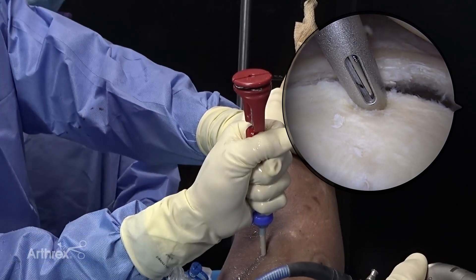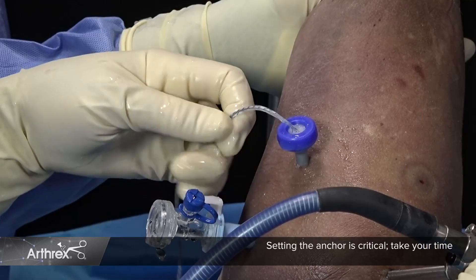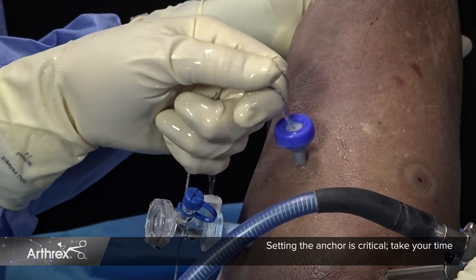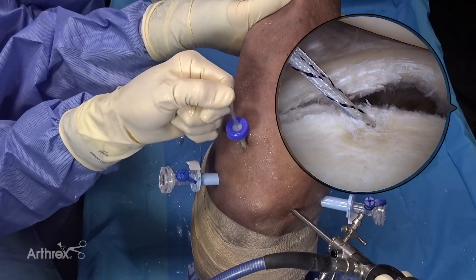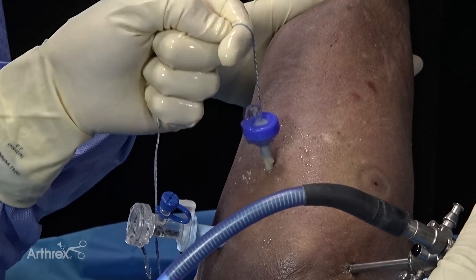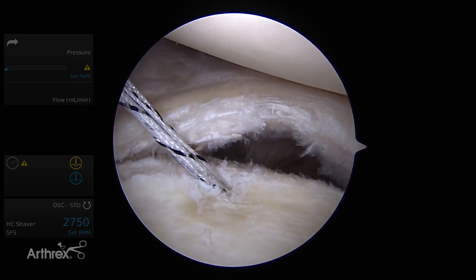At this point, you're ready to set your anchor, and I would encourage you to take your time during this step. Once the drill guide is removed, I recommend grabbing all the sutures and gently applying a steady pull in line with the cannula to set your anchor. I would also advise visualizing the anchor setting with the scope. You can certainly see how sturdy this anchor is, as I am able to tug hard even in cadaveric bone without pullout.